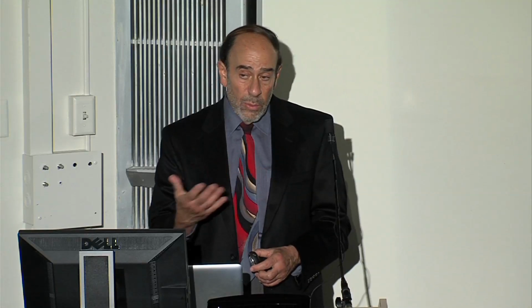Some people are claustrophobic. It takes a lot longer than a CT scan. We can now do a CT scan of 1,000 images in about 9 seconds. Whereas when I first started doing this, when I worked with the Varian Corporation at Stanford, we had the fastest scanner by far in the world: 6 seconds per image. Everybody else was like 35 seconds. In 6 seconds, I can do 500 images now, and they're thinner. And that gives me much better data for 3D, et cetera.